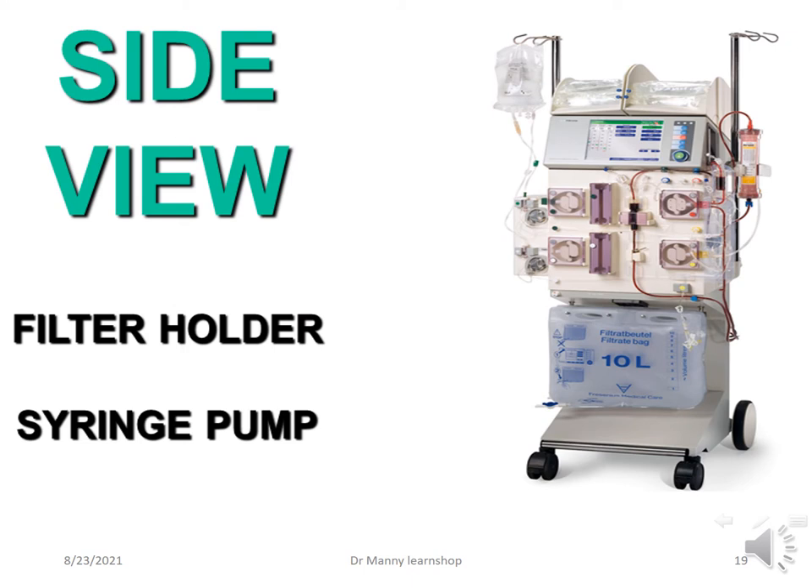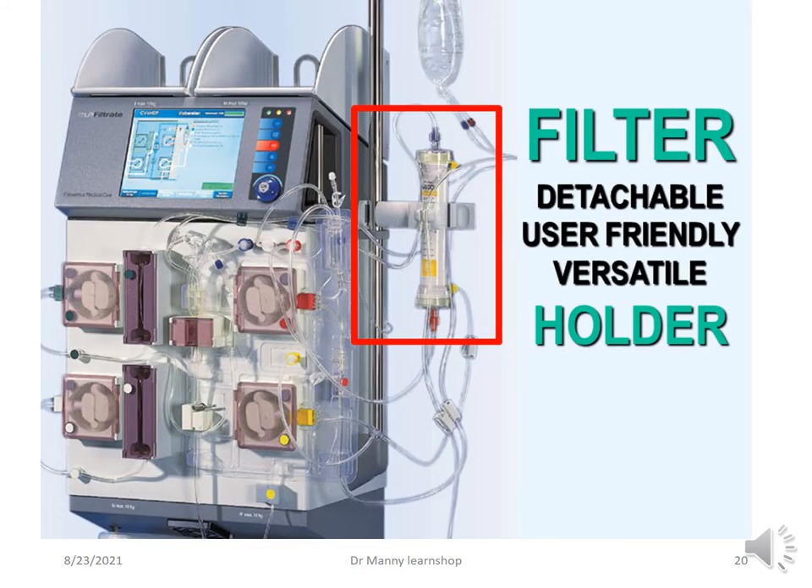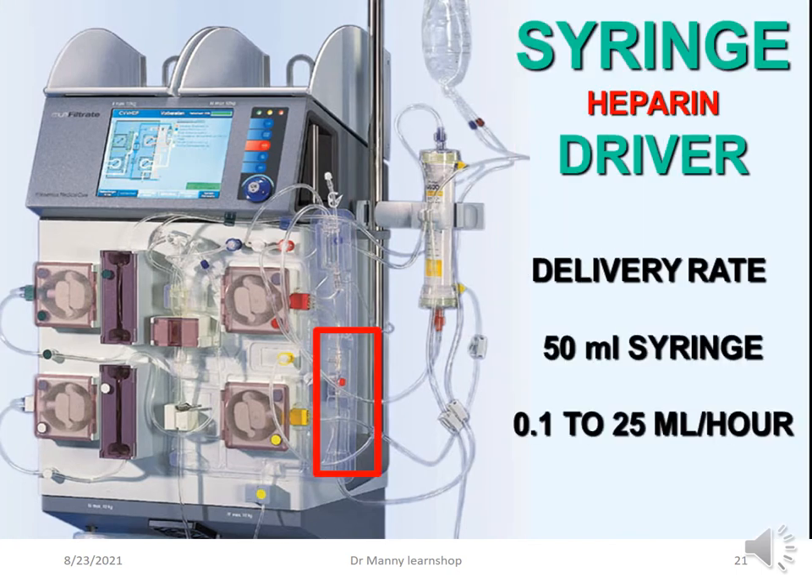On the side view there is a filter holder — the hemofilter holder — and a syringe pump holder. The syringe pump can be used for heparin if heparin is the choice of anticoagulation. The filter is detachable, user-friendly, and versatile in its holder. The syringe driver for heparin has a delivery rate requiring specifically a 50 ml syringe, and can deliver anything from 0.1 to 25 mls per hour.